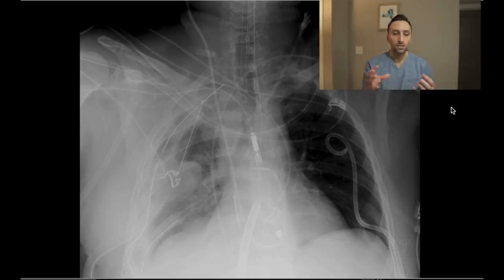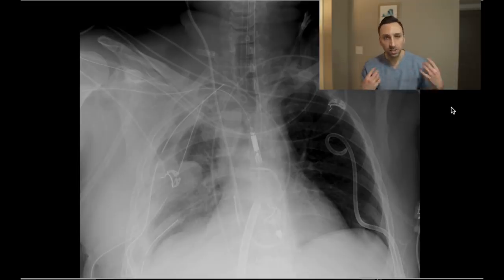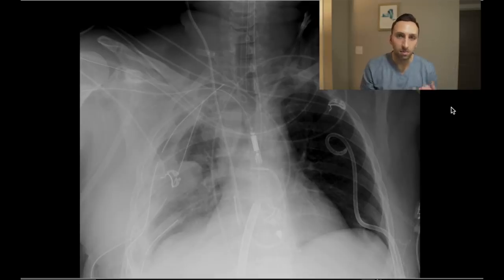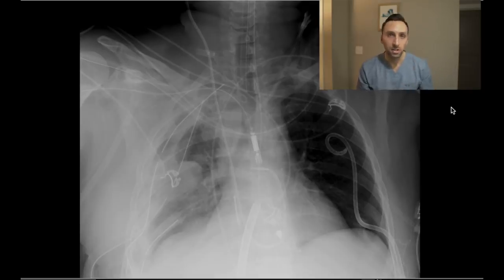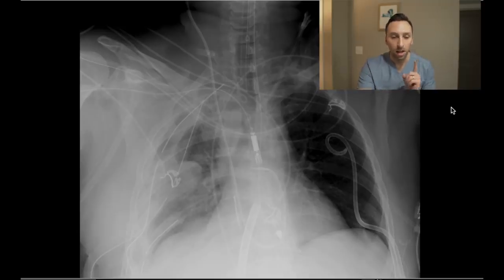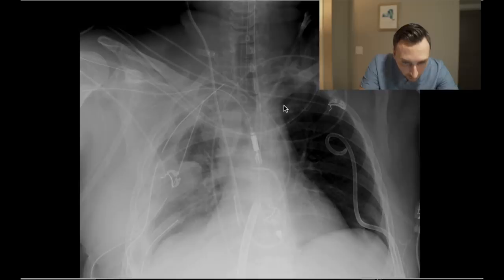When you have a ton of tubes, layering EKG leads, and everything like this patient has, it's very easy to miss a line, or miss a malpositioned line or tube, and cause the patient harm. So that is my number one priority in these x-rays.